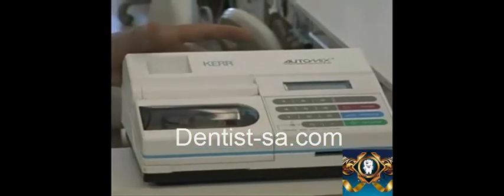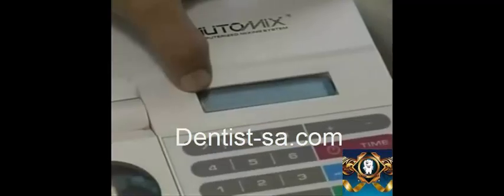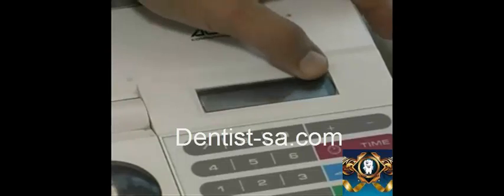Turn on the amalgamator using the on-off switch in the back. When turned on, a default mixing speed and length of time are shown on the display window.